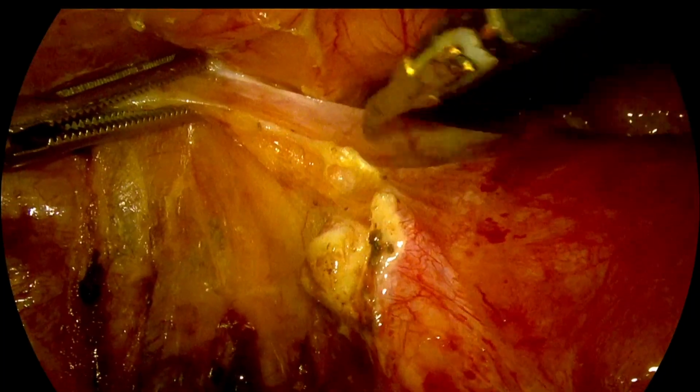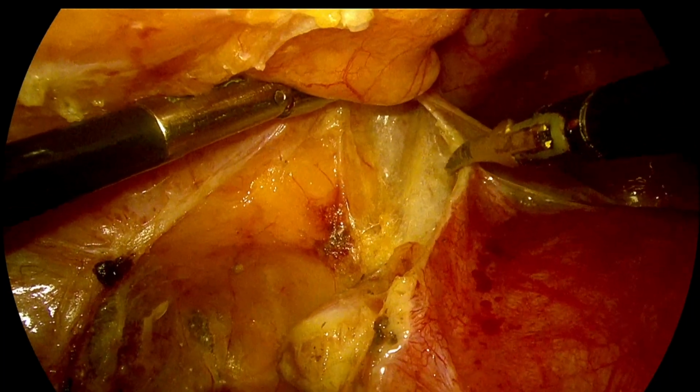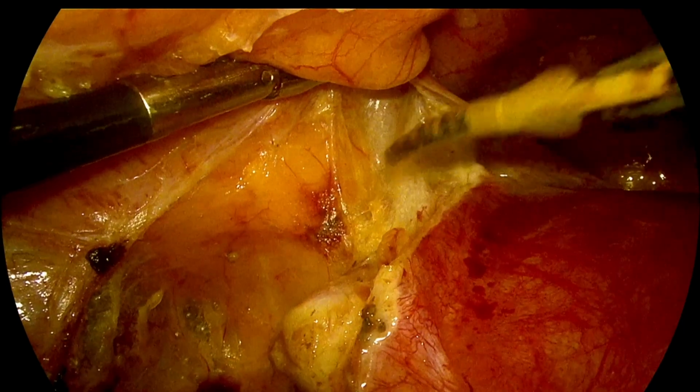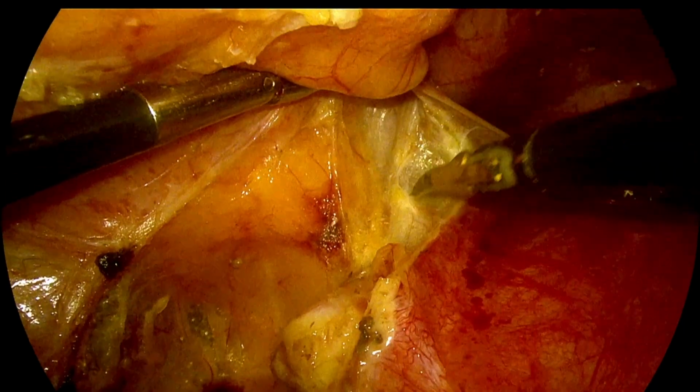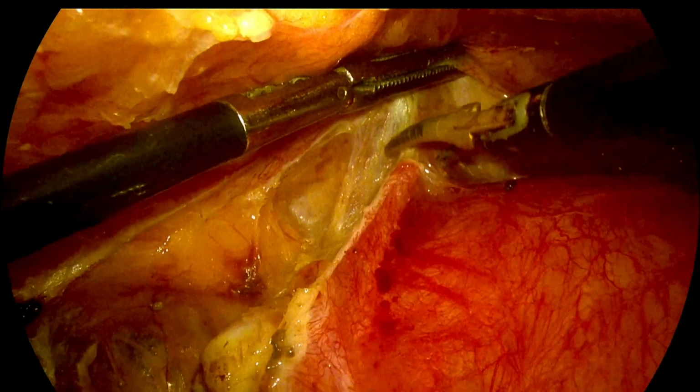As we always remind, any fat present near the bladder always belongs to the bladder, and the fat near the rectum belongs to the rectum.